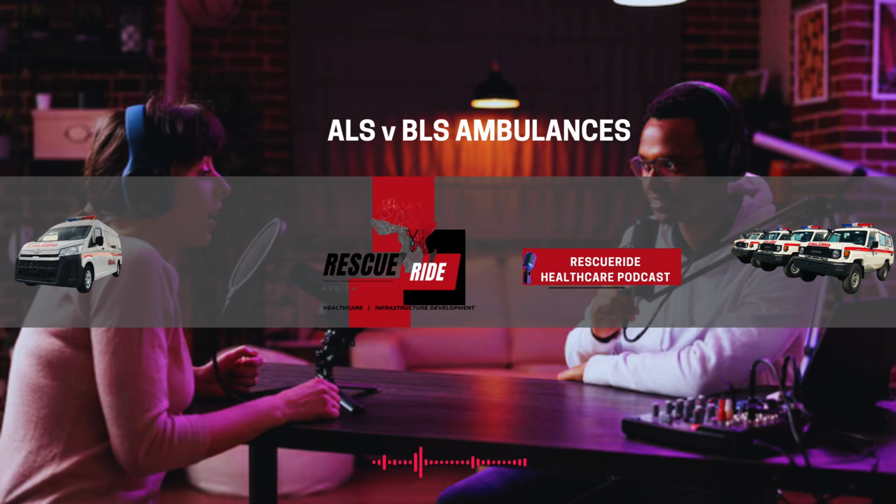Well, let's imagine a situation where someone's airway is compromised and they need more than just a mask or basic airway maneuvers. ALS ambulances carry laryngoscopes. Laryngoscopes. Yeah, these are tools that help paramedics visualize the vocal cords so they can insert a breathing tube, which is essential for patients who can't breathe on their own. That sounds pretty intense. Is that even possible to do in a moving ambulance? It is. Paramedics at the ALS level undergo extensive training so they can perform these procedures safely and effectively, even in a moving ambulance.